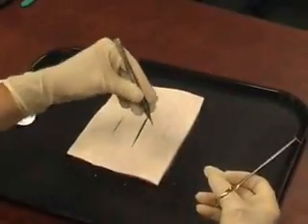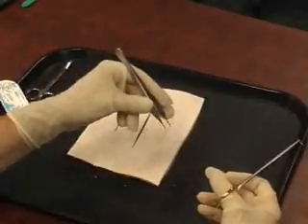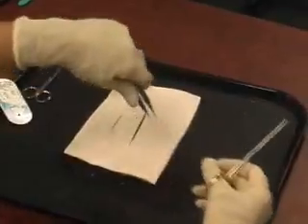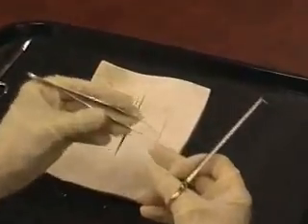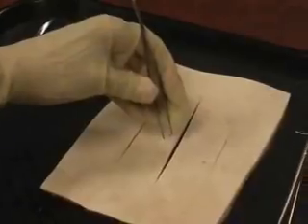You're holding it like you would if you were writing or holding chopsticks. This is the best control. You have the best functional ability this way, so try to really avoid holding in this position. That's the only thing you have to remember over here. The other thing is there are very, very small teeth here, and you don't want to overly traumatize the tissue that you're holding.